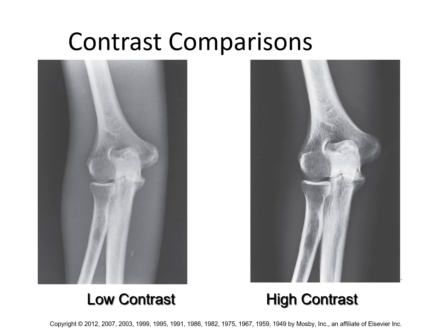Just look around the image. You can see what you would consider black, what you would consider white, and then there's an eggshell white, and then there's a light gray, a dark gray, a medium gray. So on the left-hand picture, there's about 7 or 8 different colors depending upon how your eyes work.